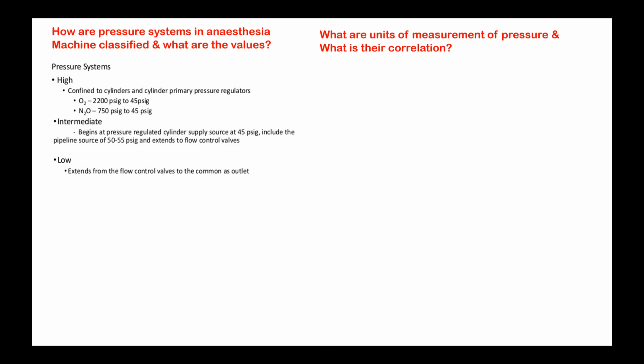I will put this question in some other way. Supposing you use an oxygen cylinder for giving anesthesia and the cylinder becomes empty. The pressure gauge now reads 0. Does that mean that the oxygen cylinder will not have any gas at all? It will be totally empty? No, sir. It's relative to the atmosphere, it's 0. So there will still be a small amount of oxygen left in the cylinder, at atmospheric pressure because there is no gradient.